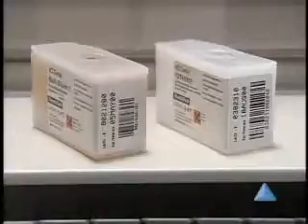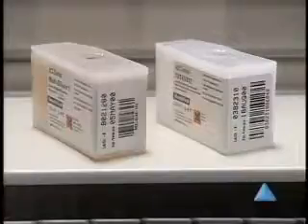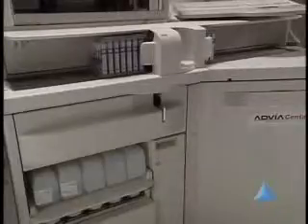In addition to the ready packs, some assays require ancillary reagents. Ancillary reagent packs are barcoded and contain between 10 and 25 milliliters of diluent or releasing agent. Ancillary packs can be added or removed from the 15-position refrigerated compartment without interrupting operation.